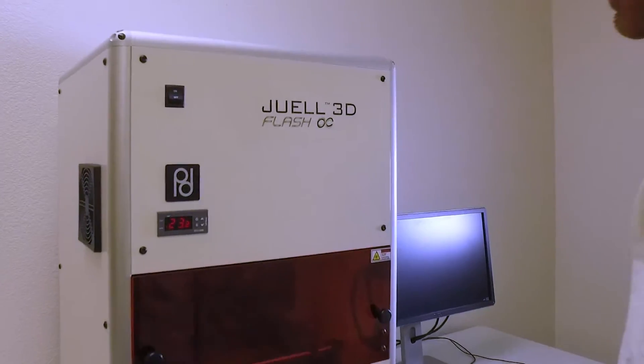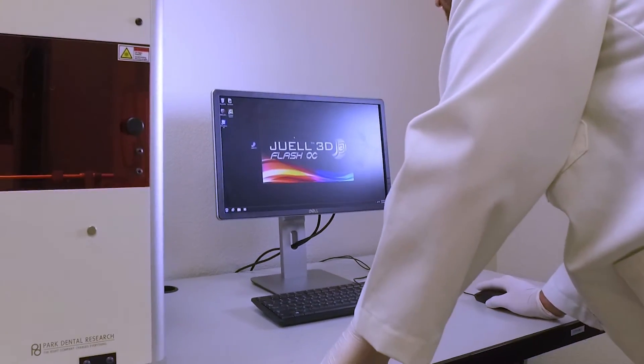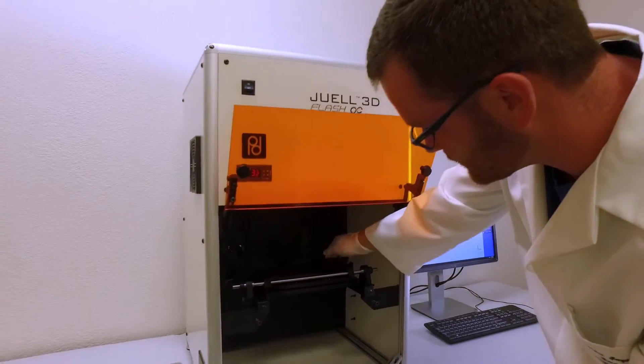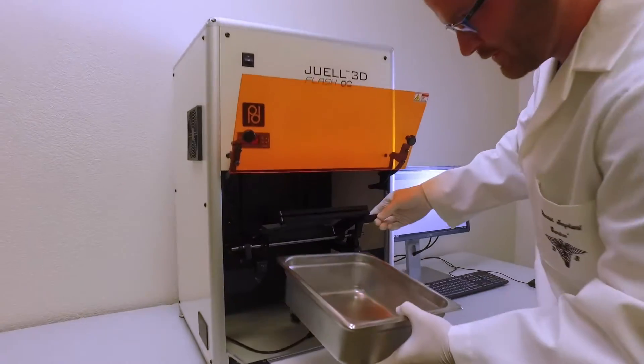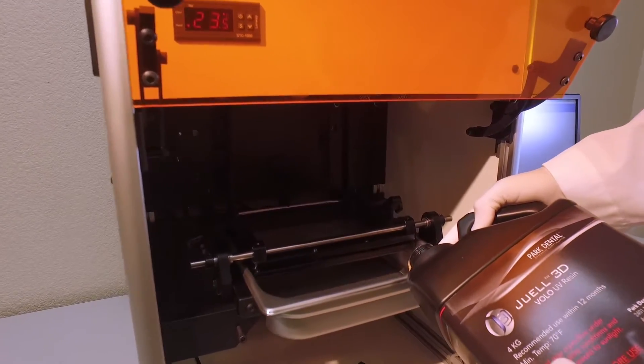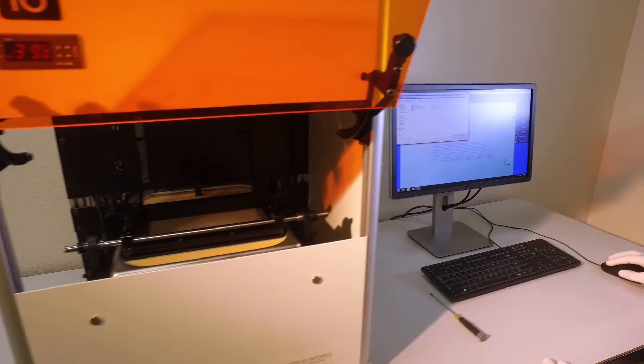The Juul 3D Flash OC is easily one of the most user-friendly stereolithography 3D printers available. Preparation for printing is simplified with only a few basic steps. Loading a day's or even a week's worth of building material is a simple matter of filling a tub with Juul custom blend resin.